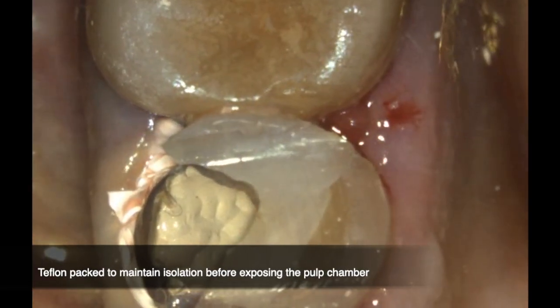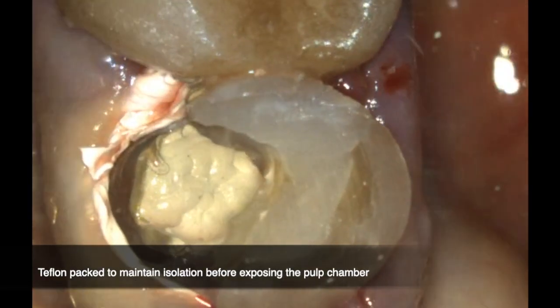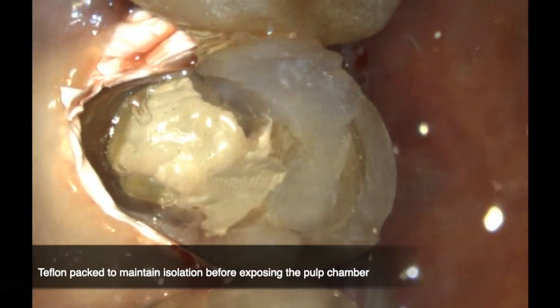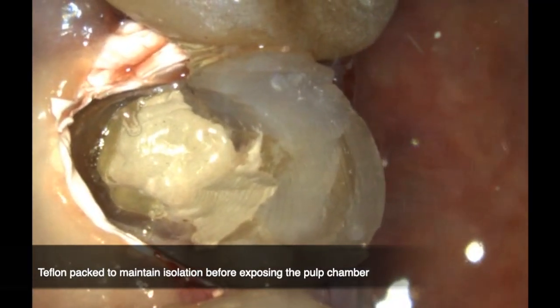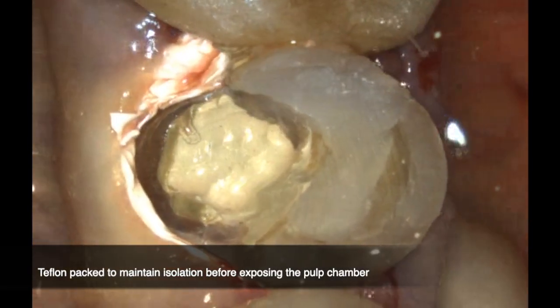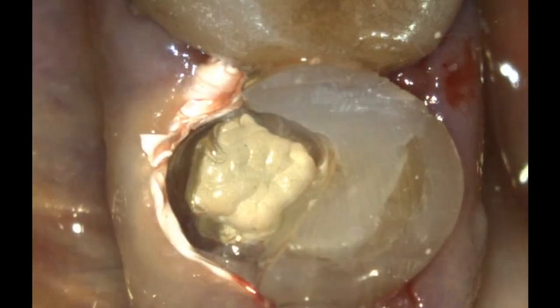The first thing I do is pack Teflon around the deepest areas of the margins. This is to ensure that I maintain isolation — I don't want any crevicular fluids or blood getting into my pulp chamber once I start excavating all the old restorative materials and the temporary filling that the endodontist had placed in the pulp chamber.